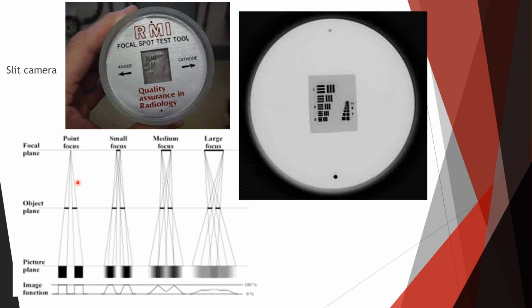And again, this is a diagram of how the focal spot is projected, and really a lesson in umbra and penumbra, where umbra is the main region and penumbra is the blurriness region due to the object. The larger the focal spot becomes, the more this blurring occurs, as we can see here.